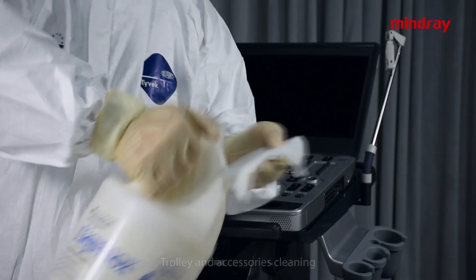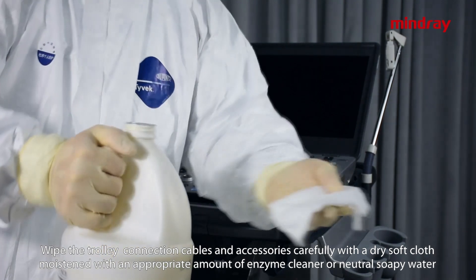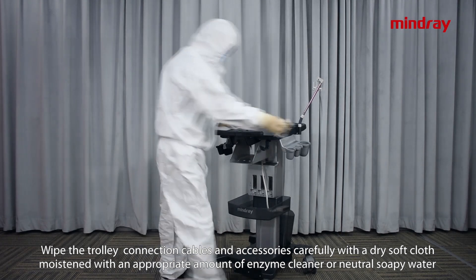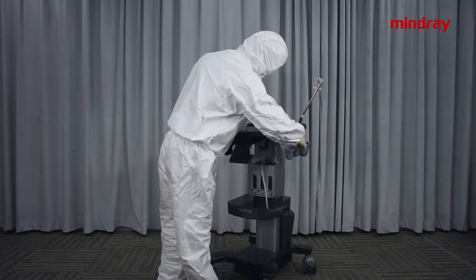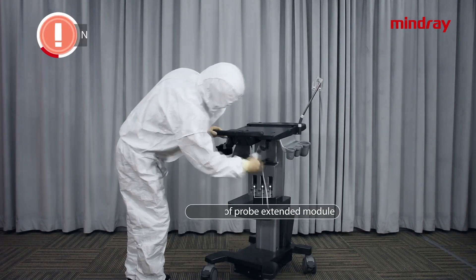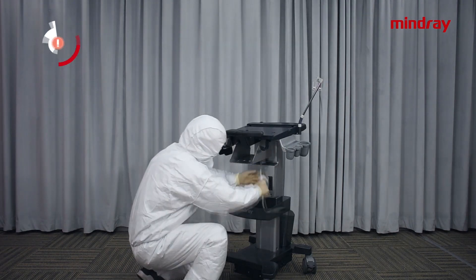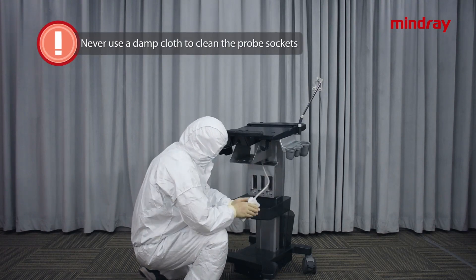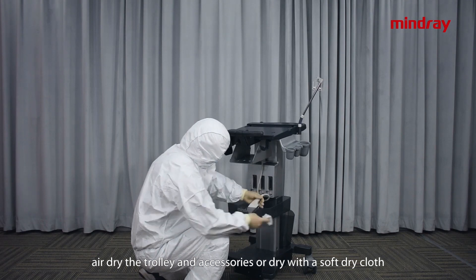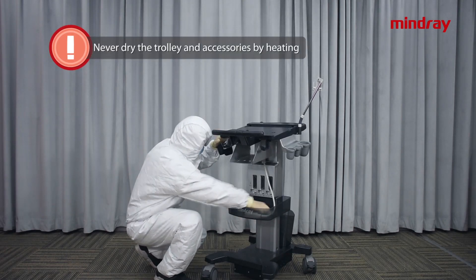Trolley and accessories cleaning: wipe the trolley, connection cables, and accessories carefully with a soft dry cloth moistened with an appropriate amount of enzyme cleaner or neutral soapy water to remove dust and stubborn stains. Caution: never spill liquid into the probe extended module. Use a damp cloth to clean the probe sockets. After wiping, air dry the trolley and accessories or dry with a soft dry cloth. Never dry the trolley and accessories by heating.